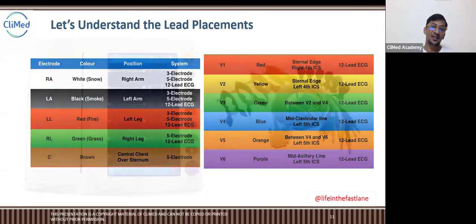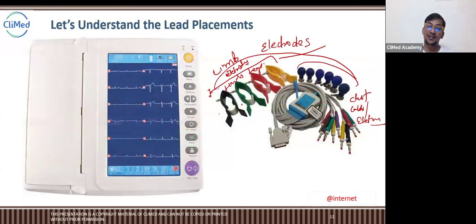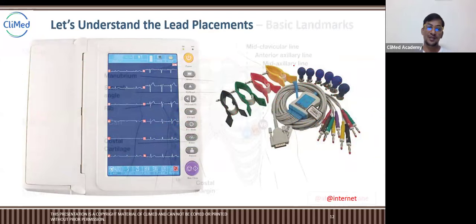Right now you understand, these are the colors right here. Okay, so wire colors here, you will get the wire colors here. Not these colors, sometimes these colors are the same, but the wire colors which are coming, you can easily understand by them. This is white, okay, this is red, green, black. Sometimes it's yellow, sometimes white, so this depicts the red.